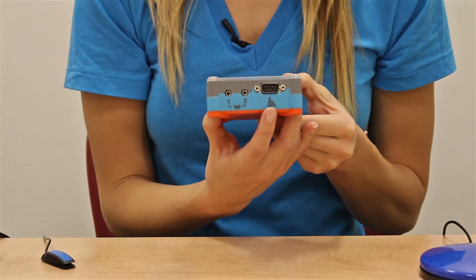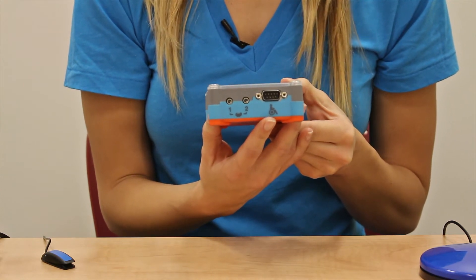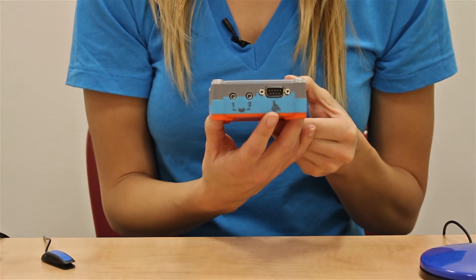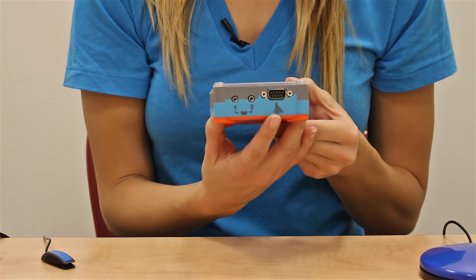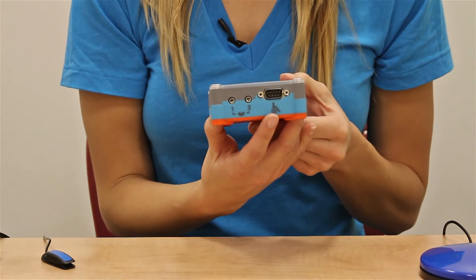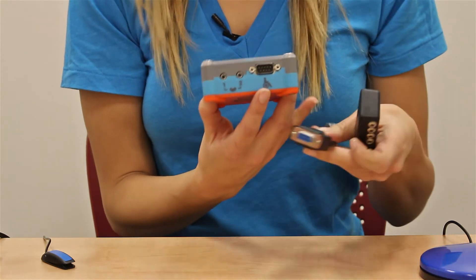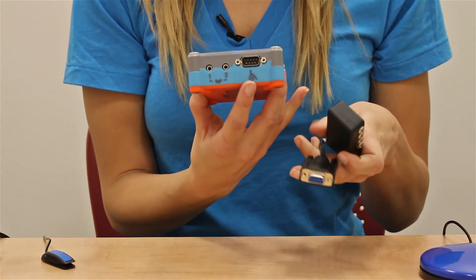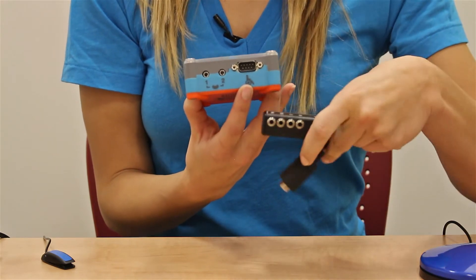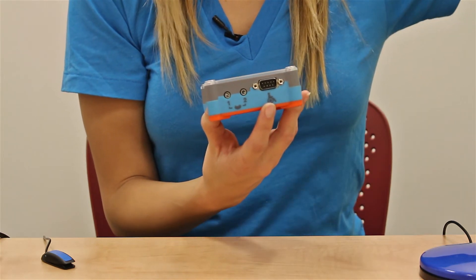The wheelchair port can be connected to the environmental control unit or input-output module of power wheelchairs to control the phone or tablet using any driving controls like joysticks, head arrays, or sip and puff controllers. The wheelchair port also accepts multiple switches like a joystick which is separate from the wheelchair. If you want to use more than two switches, we have a multiple switch adapter that plugs into the same wheelchair port. It accepts an additional four switches for a total of six independent switches.